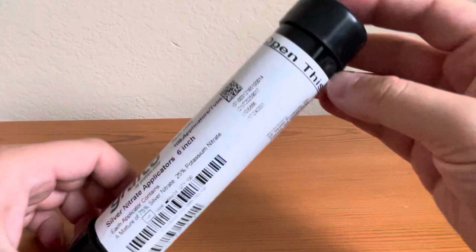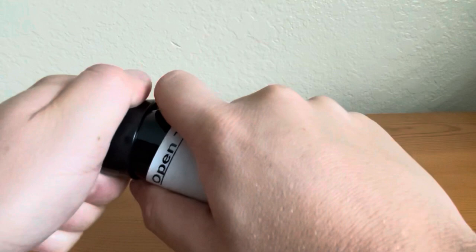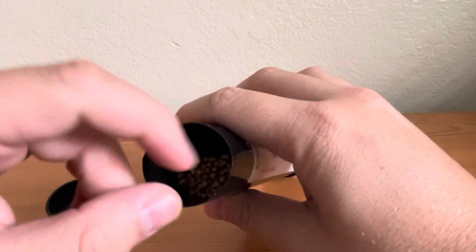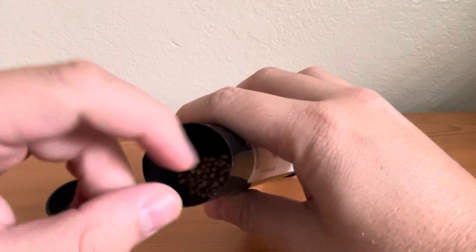You want to store in a closed package at room temperature in a dry place protected from light. Silver nitrate will oxidize and turn dark brown upon exposure to light.